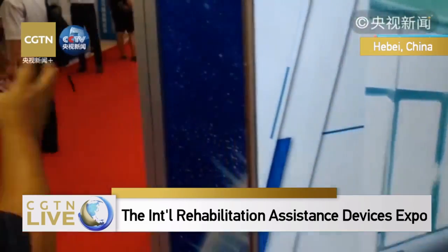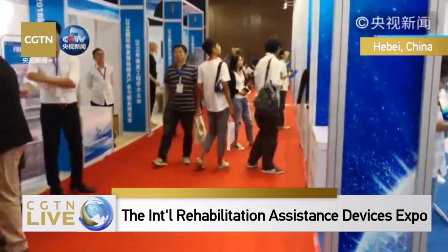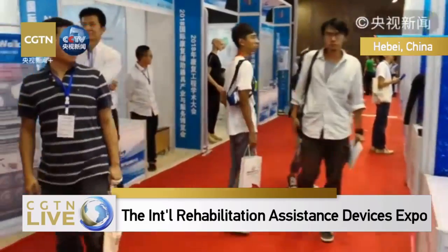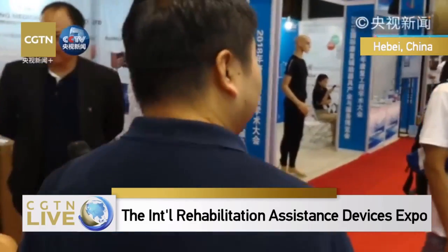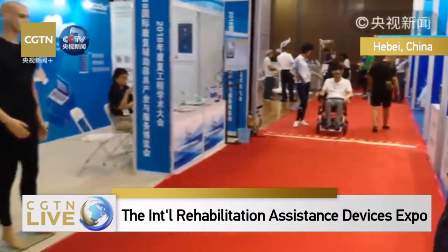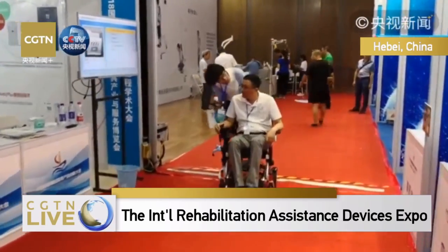For this exhibition hall for universities and research institutions, how many entities are there? I think there are more than a dozen, 15, 16 exhibitors here. It's a highly selective expo. We only invited the best.